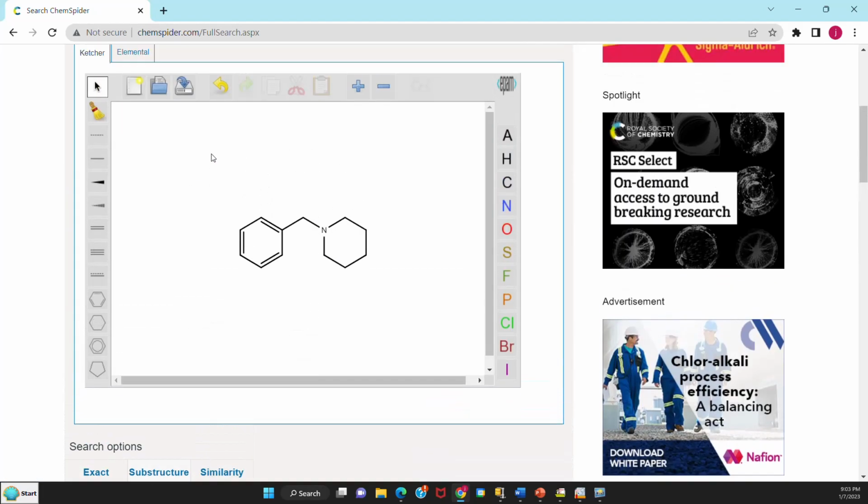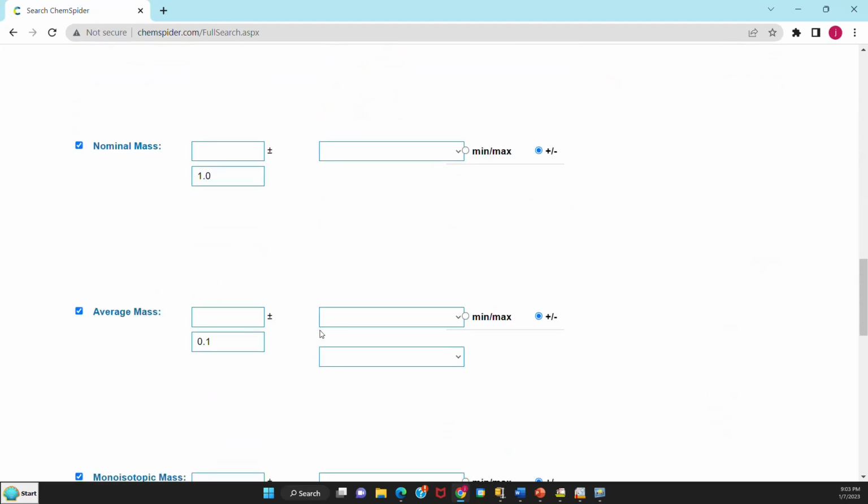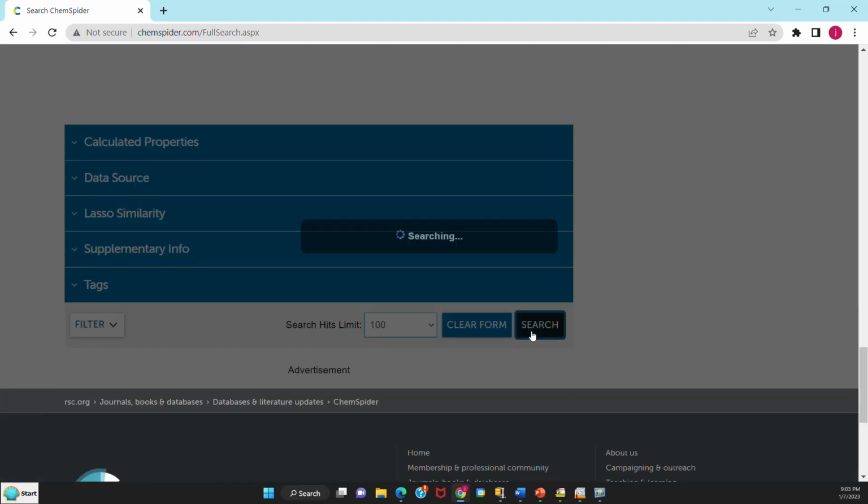So that's good. We still have our molecular structure, the substructure, drawn. So we ought to be able to do a search now and limit it by those two. So do a search. Should say searching. That looks good. The searching icon or the box came on in the middle. Wait for that to get through.